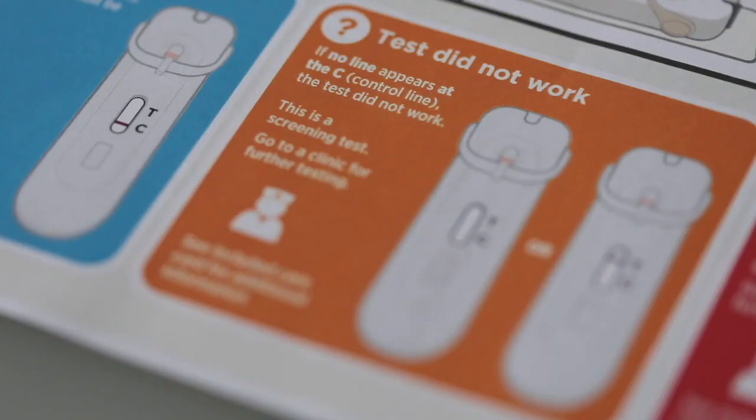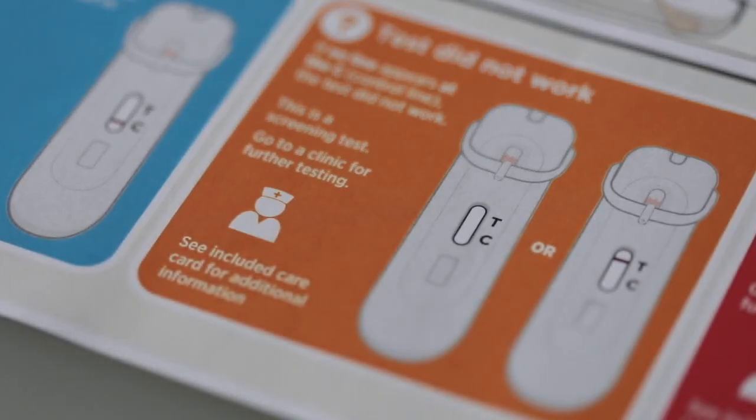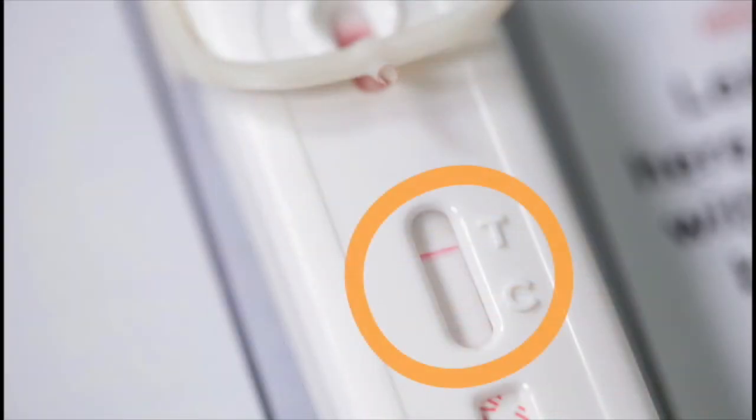Look in the orange box called test did not work. If no line appears next to the C, then the test did not work, even if a line appears next to the T. Because this is a screening test, go to a clinic for further testing.